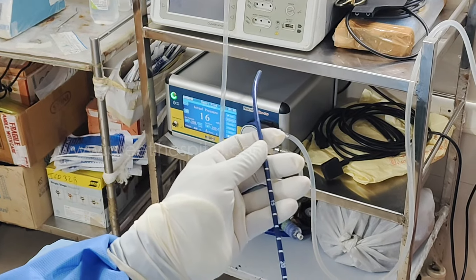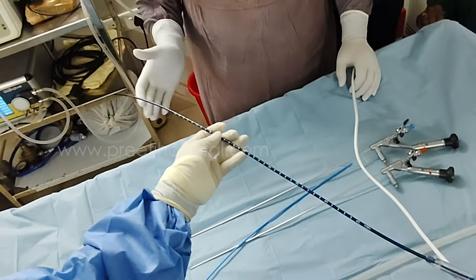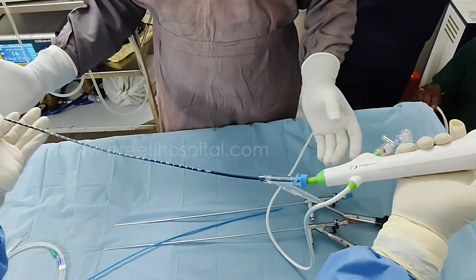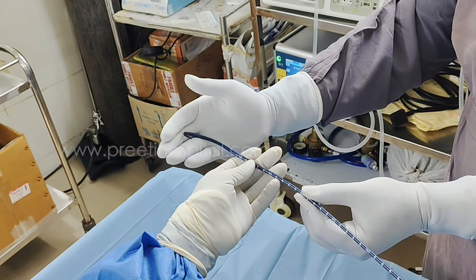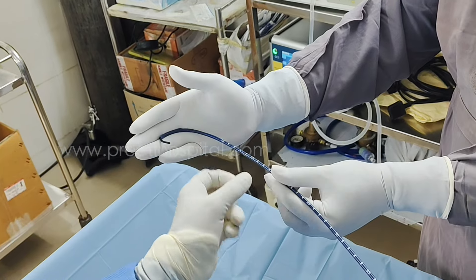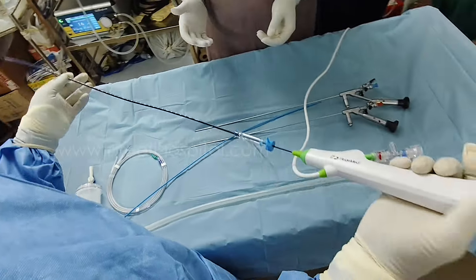Usually what we do is: we go inside the sheath like this, and one person holds here and pushes the sheath — push, push, push — over the bent scope. Pushing the sheath over the bent scope is less traumatic than overall flexing. If you flex the whole thing, the sheath will go but it is more damaging. This is the most important point.